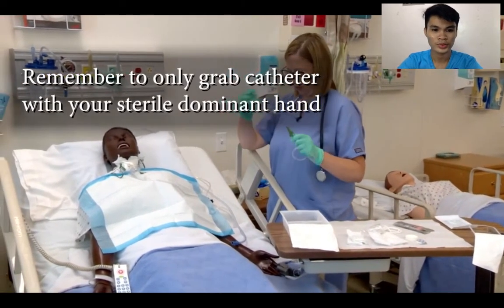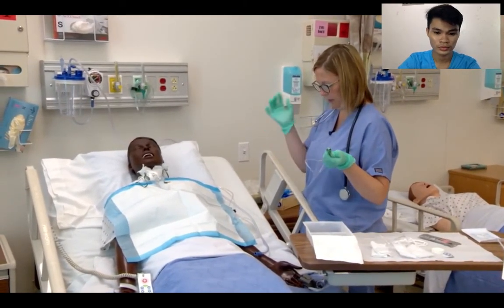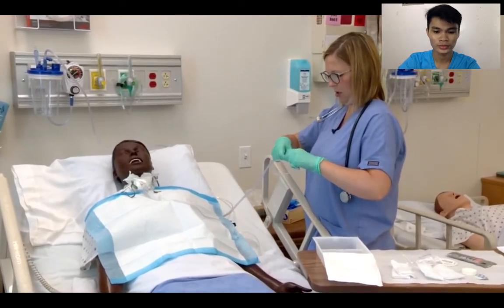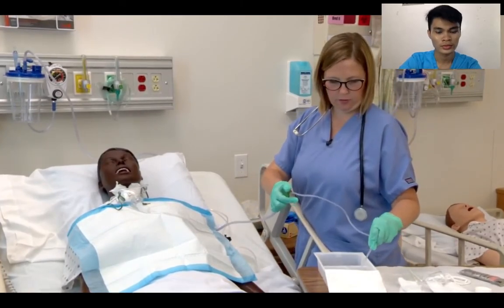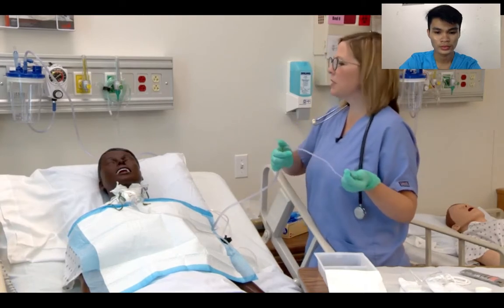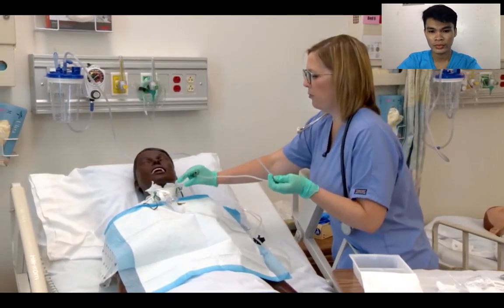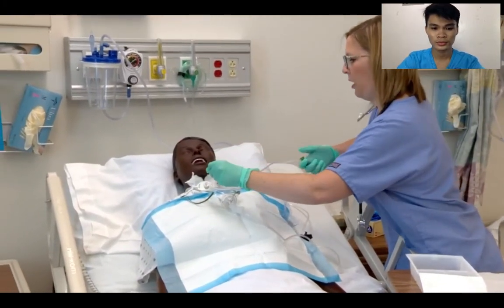Now it's important that once I start suctioning that I'm always keeping my left hand, which is my dominant hand, sterile, and my right hand clean. Okay, I'm going to attach the two together. Okay, I want to prime my suction catheter with the normal saline. Okay, all right, Mr. Jones, I'm going to go ahead and suction you. Go ahead and take some nice deep breaths. Okay, good. Great color. And now I'm going to go ahead and apply suction.